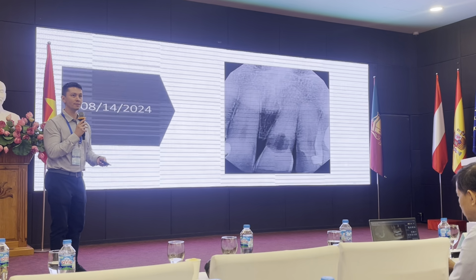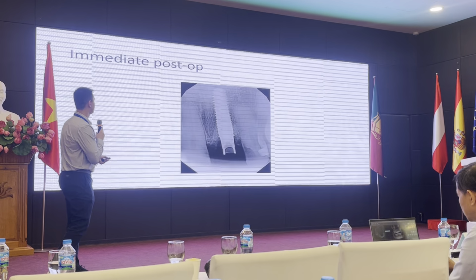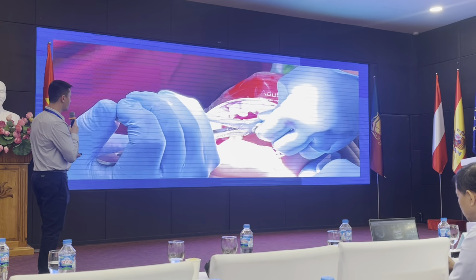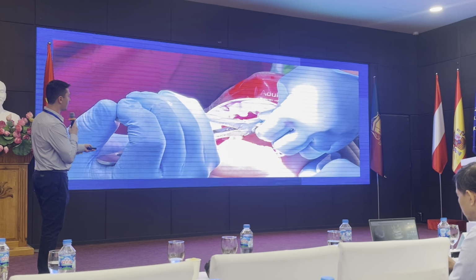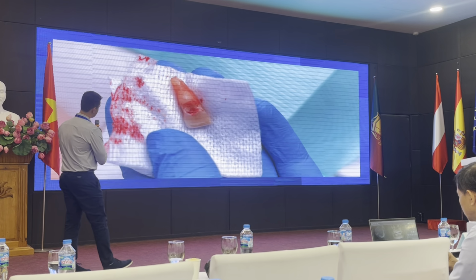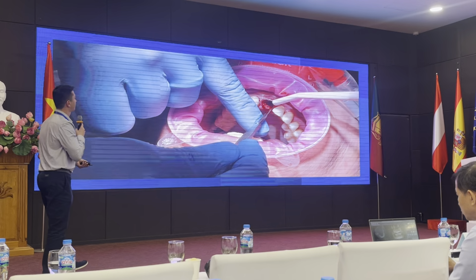Don't be in a hurry. This isn't fast dentistry. Want to do it right. Remove the tooth. So I'm using a forcep here only because we already had mobility of the tooth. Tooth comes out in one piece. Sometimes they don't. Sometimes they break and you can't help that.